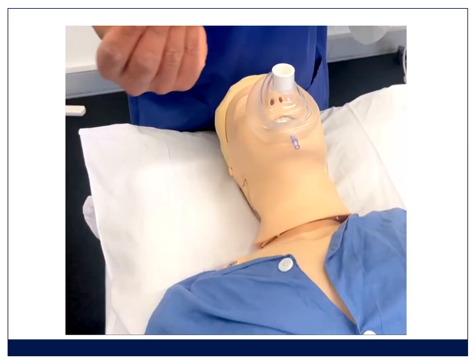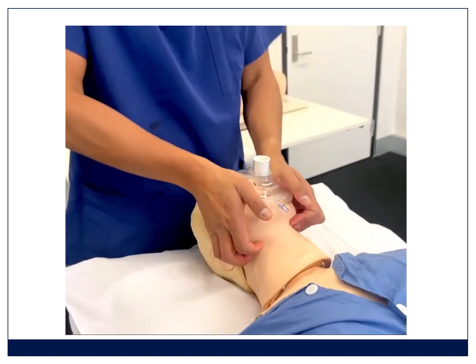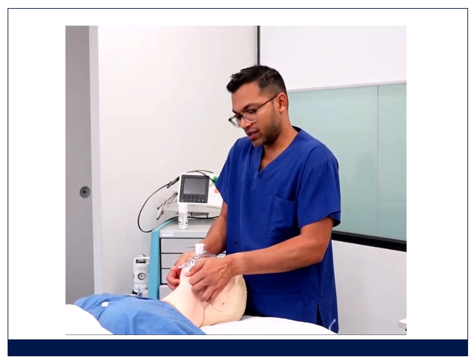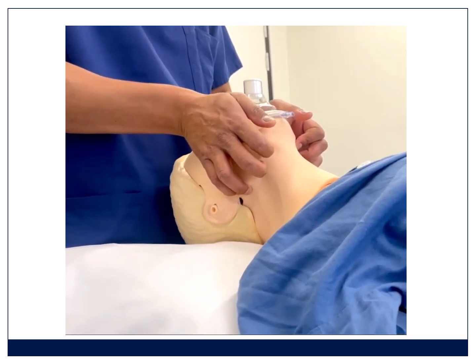the mask ventilation. So if you want to see a video of somebody doing that, this is what it looks like. You can see he's getting his hands underneath the angle of the jaw and just using his thenar eminences or his thumbs to hold that mask down, and now I can really lift that jaw up. And if that's not working, I get all 4 of my fingers underneath the angle of the jaw. But this technique is a very useful one for doing difficult mask ventilation.